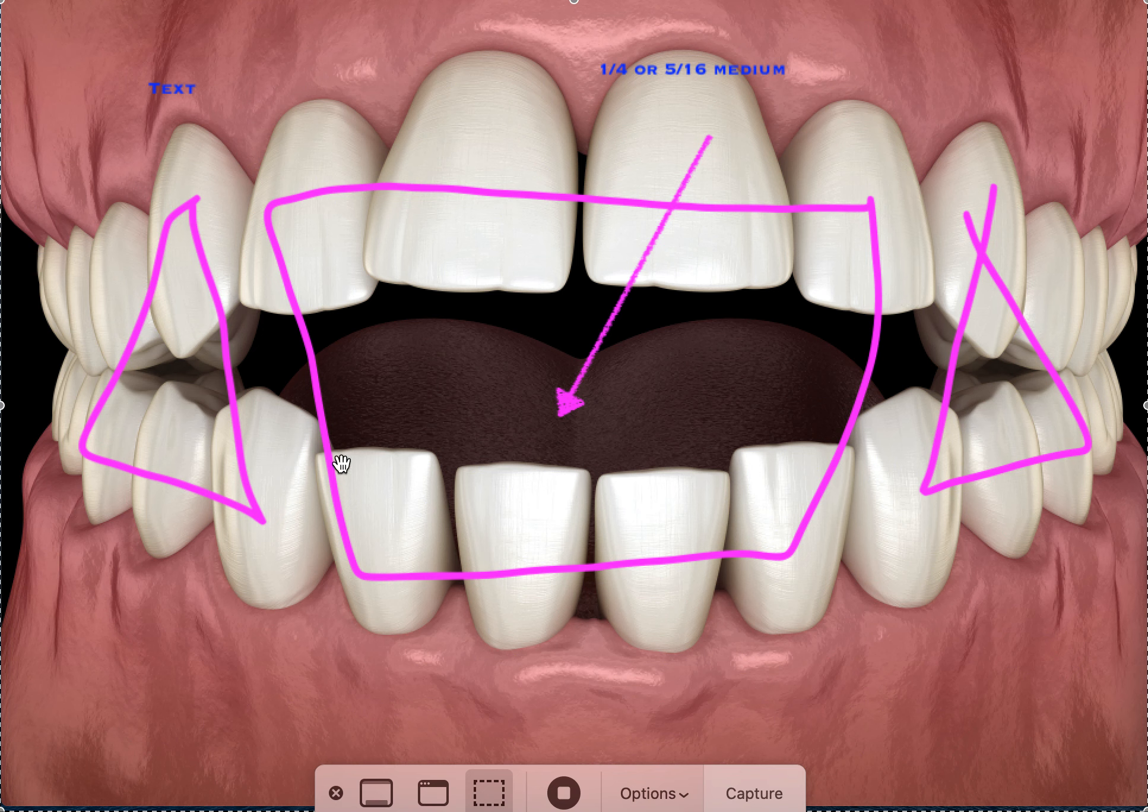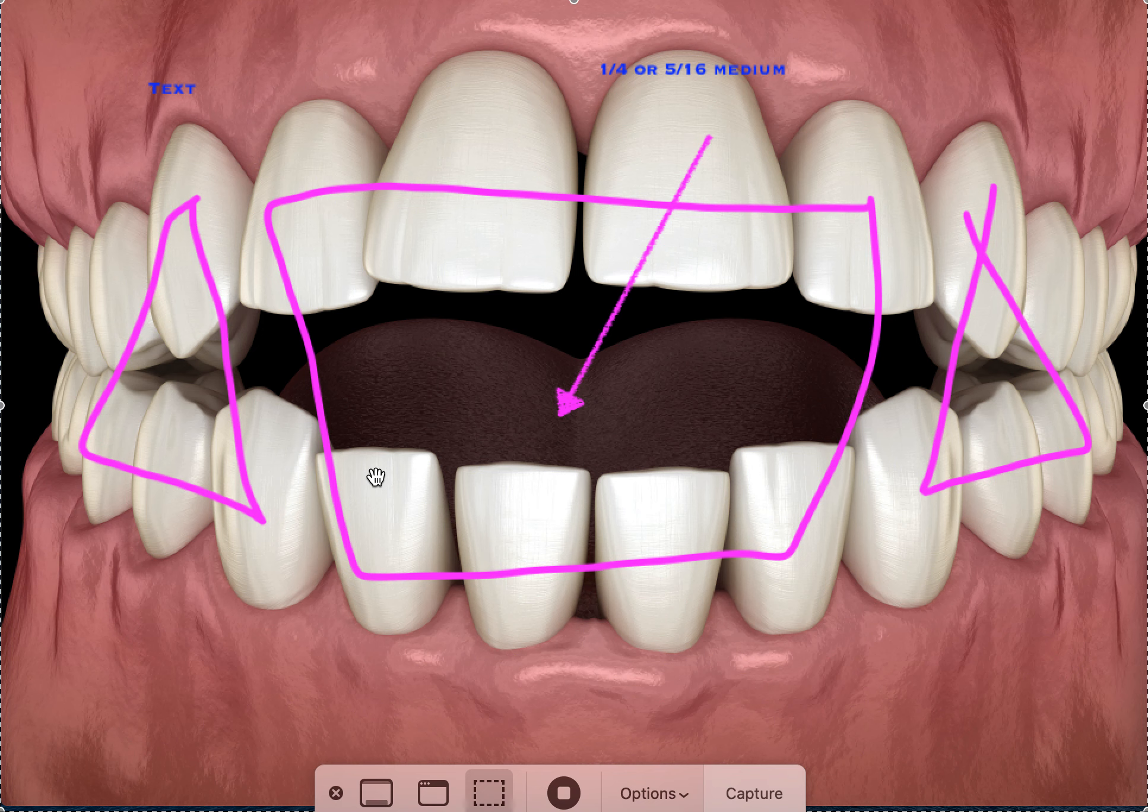This anterior, you're going to have to put Koby hooks on the lateral incisors. I've got videos on how to do that. You can just search up Koby, K-O-B-I, and it should come up under my videos, Koby hooks.